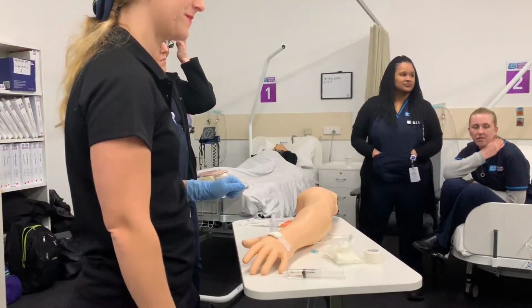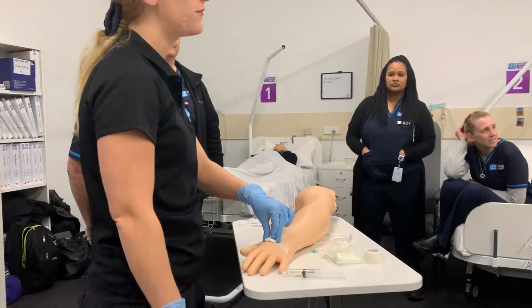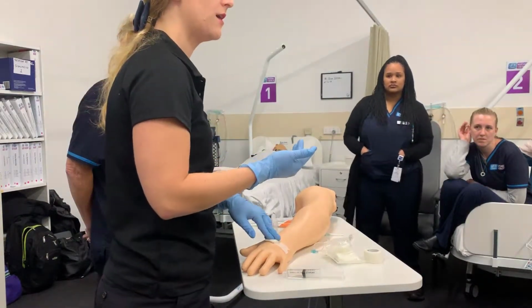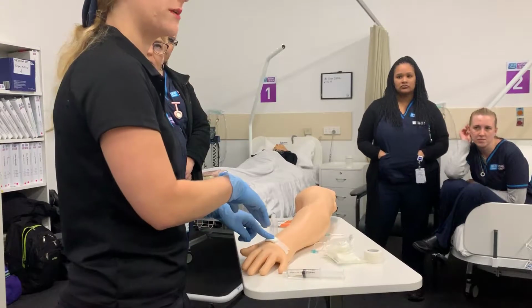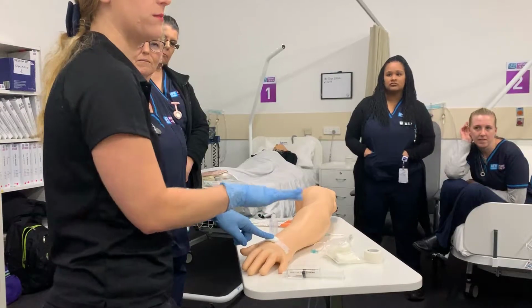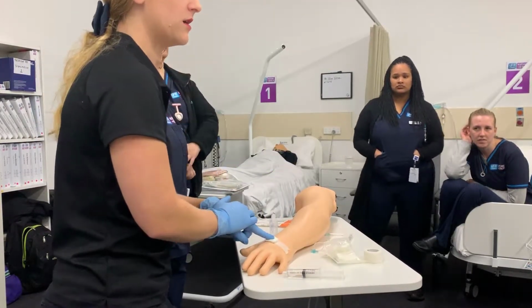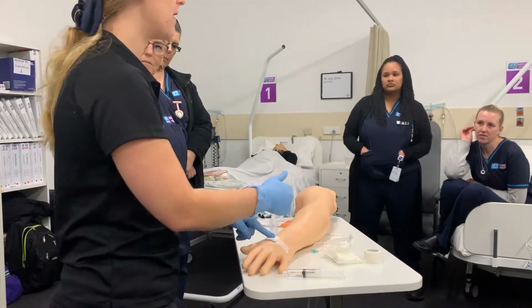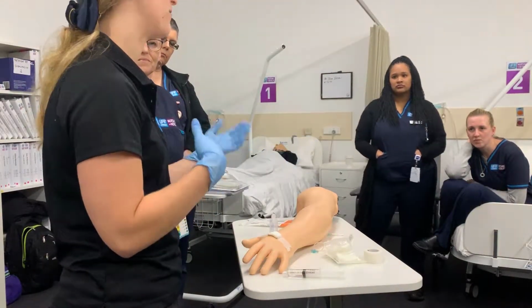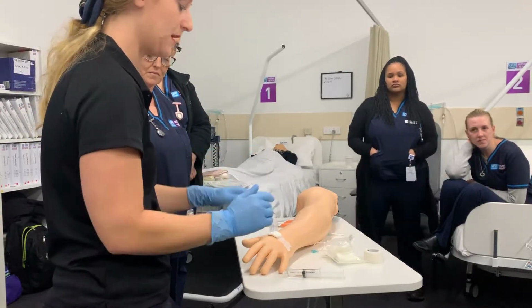So if the patient's not able to do that, do you as a nurse stay there until that stops? Yes. You don't get a family member to... It depends on the family member. Yeah. So if I've got somebody who's already been very involved in the care, then you say, are you comfortable holding pressure for the next few minutes? And then you just let them know it's just to stop the bleeding. If it's still bleeding in the next few minutes, just give me a buzz and I'll come right back. And a lot of them would be comfortable with that because a lot of people are used to having blood drawn. We've all, even if you haven't been admitted to hospital, you've had blood drawn, it's the exact same concept, you still need to hold pressure, okay?